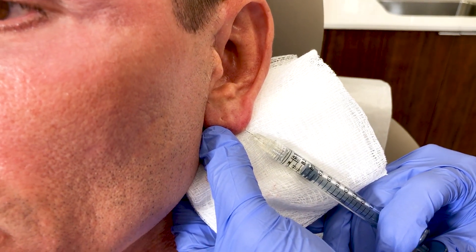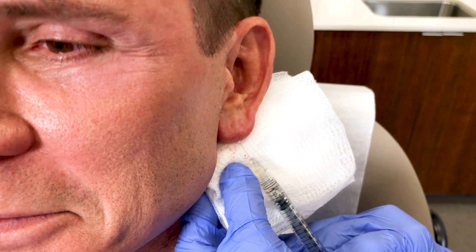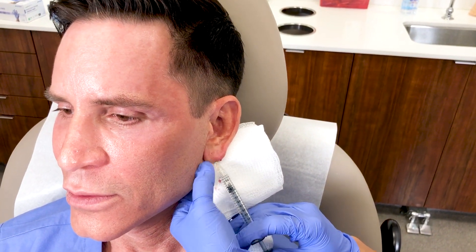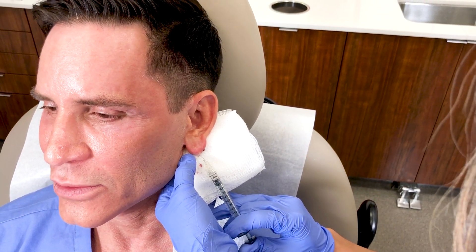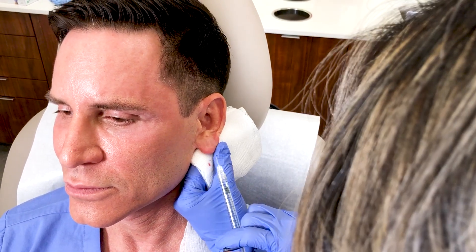How are you feeling? Do you feel anything? I feel nothing, actually — I really feel nothing. There are certain areas on the face that really hurt when you get injections; the nose can really hurt and the lips can really hurt, but this is completely painless.